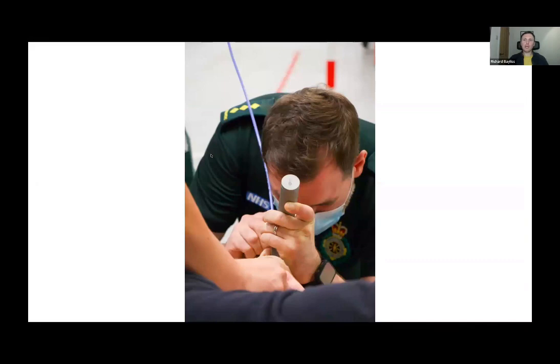But what problem are we actually trying to solve here? So pre-hospital intubation is obviously by its nature going to be really challenging. So our most common indications for intubation in the pre-hospital environment are going to be trauma and out-of-hospital cardiac arrests. So that can be either during the arrest or anaesthesia following the arrest if the patient remains unconscious.